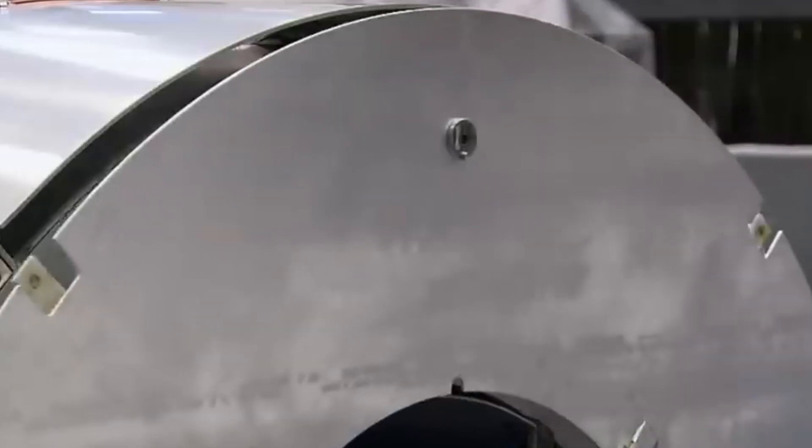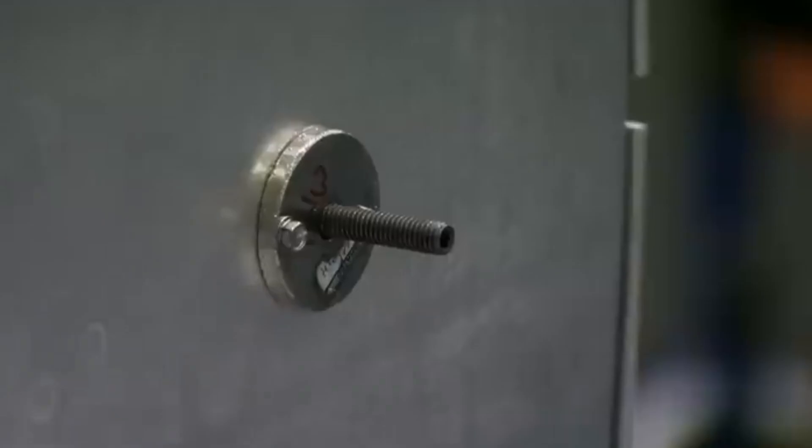They now construct a second aluminum tube around the magnet. This will act as an insulating shield.